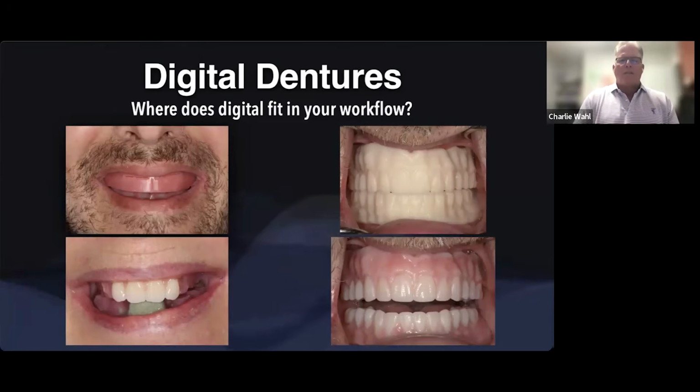can make changes, right? This is not our final denture, but more importantly, they can make sure that not only do they like them, but their spouse likes them, their siblings like them, their kids like them, whatever it is, they have something that they can eat with, chew with, and wear as long as they want, really, to verify that everything is good as it is. I want to make sure that at this stage, there's no compromise to fit. There's no compromise to aesthetics. There's no compromise, at least in tooth position, kind of like our provisionals in the dentate world, that everything is complete and acceptable. If we have minor changes, I don't need to do another try-in.